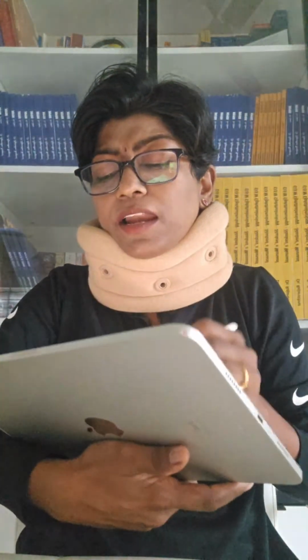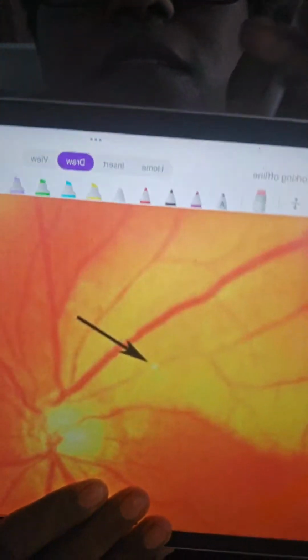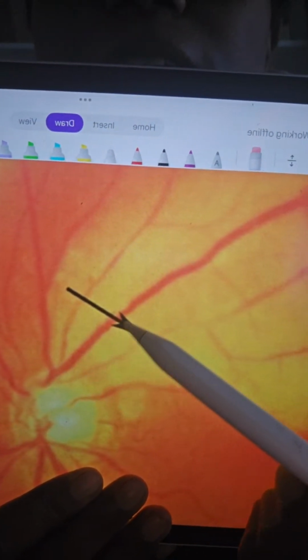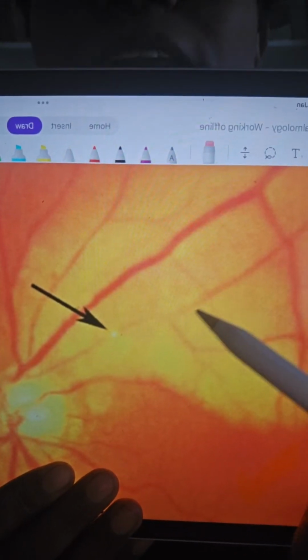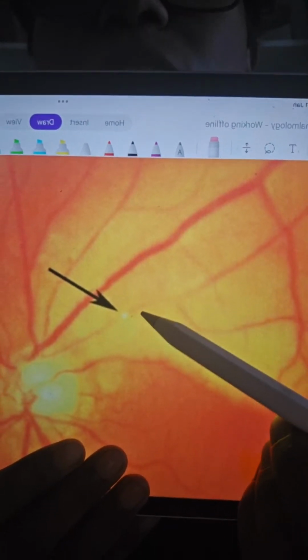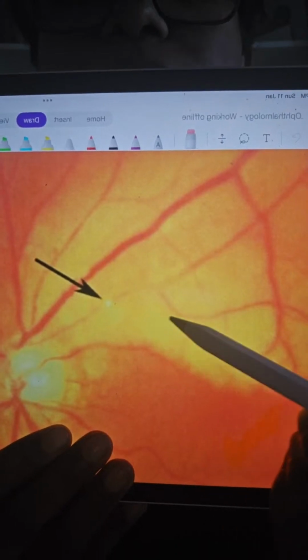Okay. Now, let's go on to see what I can see here marked with the arrow mark. If you can see the contrast, see, first of all, this is the vein. The darker thing is the vein. You can hardly see the artery here. The artery is so attenuated, so thinned out. Are you all able to appreciate? Give me a thumbs up if you're able to appreciate the thinned out arterioles.